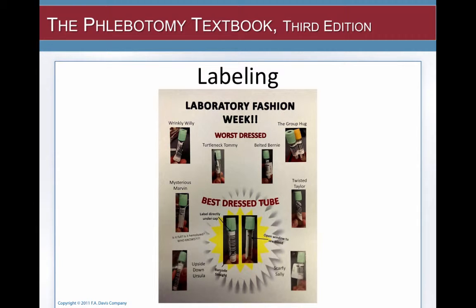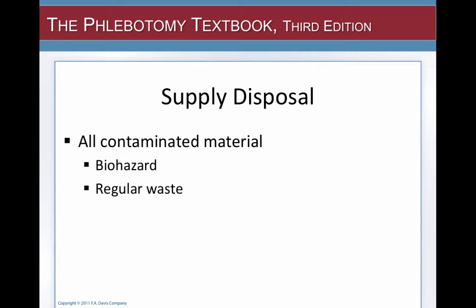And that helps the phlebotomist see how much blood they've drawn, and it helps the people in the laboratory when they spin the blood down or centrifuge it to see the plasma and to make sure that there's enough blood collected to run the tests. Make sure that you clean up all of your materials after you draw blood. Throw everything away in the regular waste paper basket, or if it belongs in biohazard, make sure it goes into the biohazard buckets or containers.